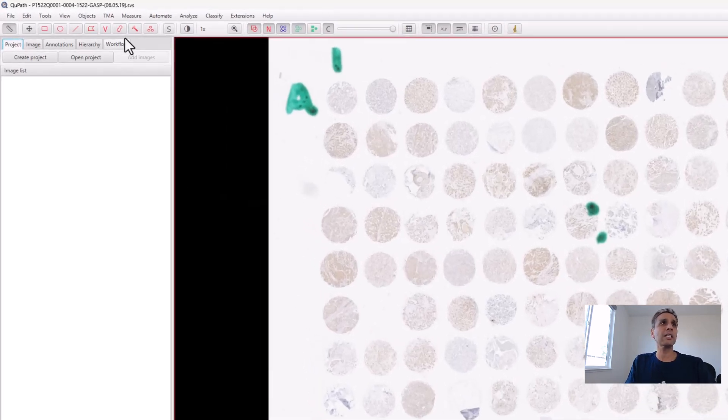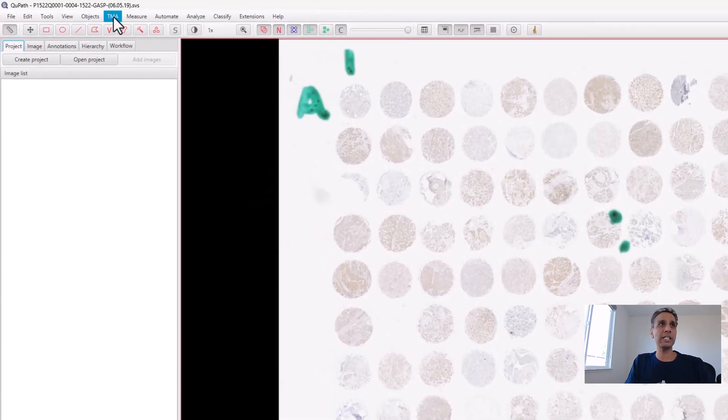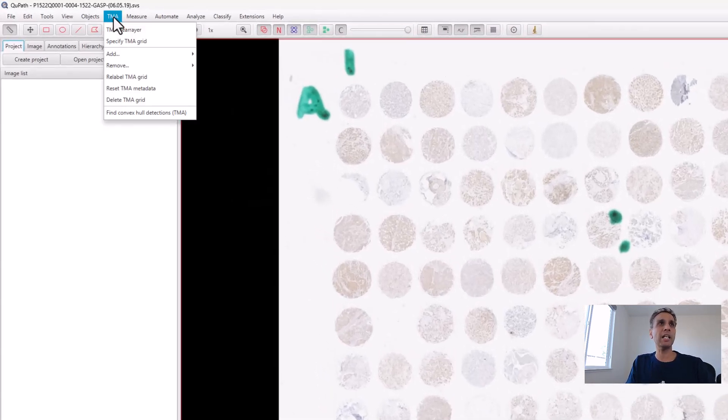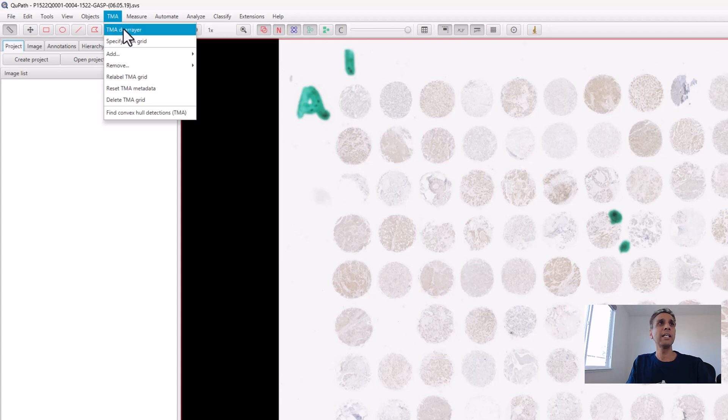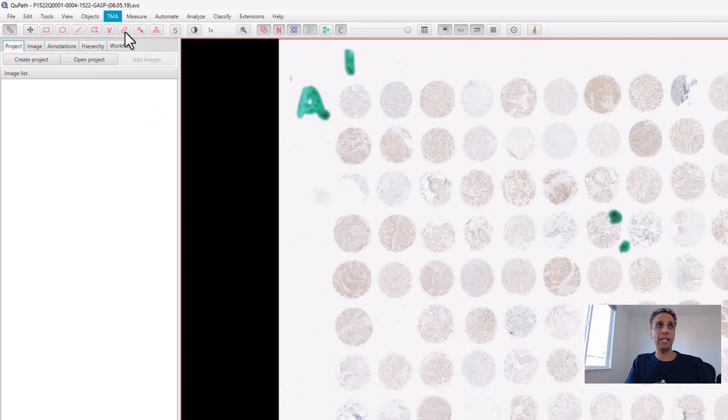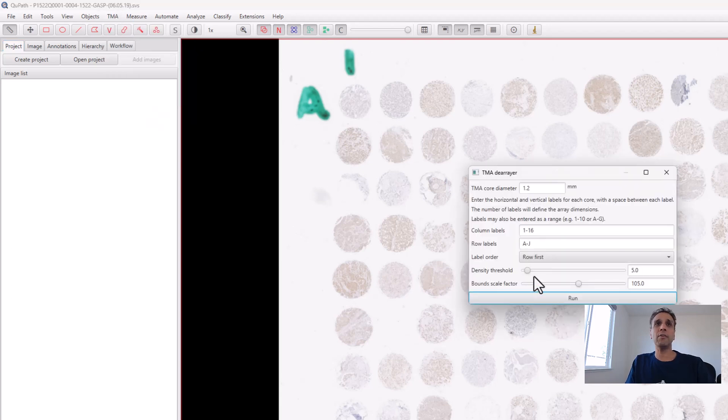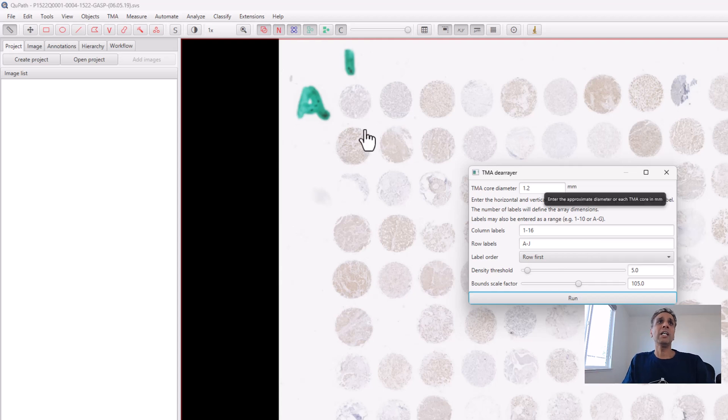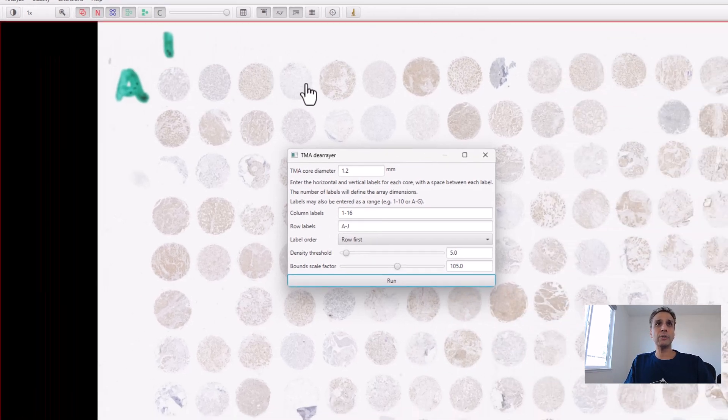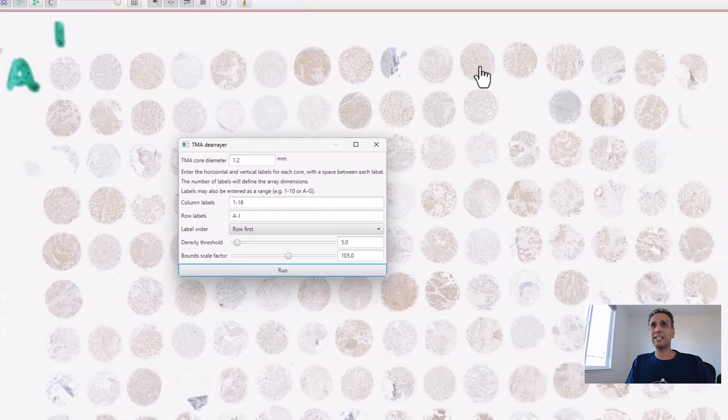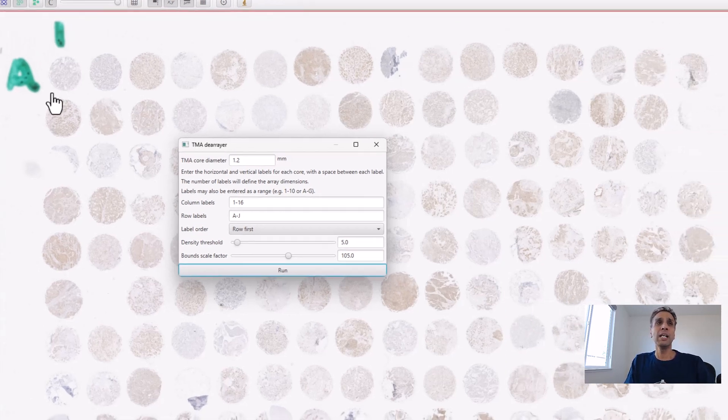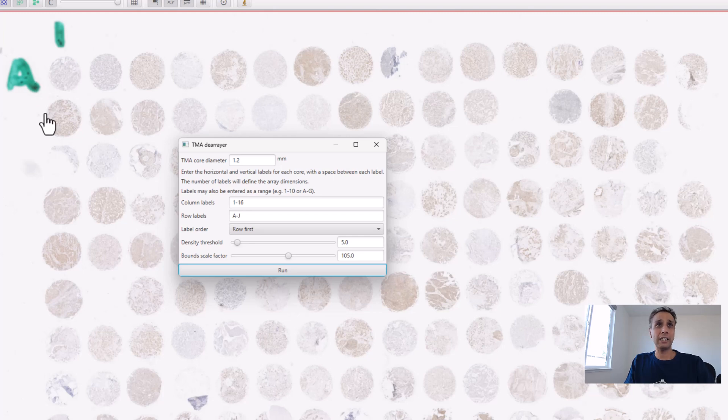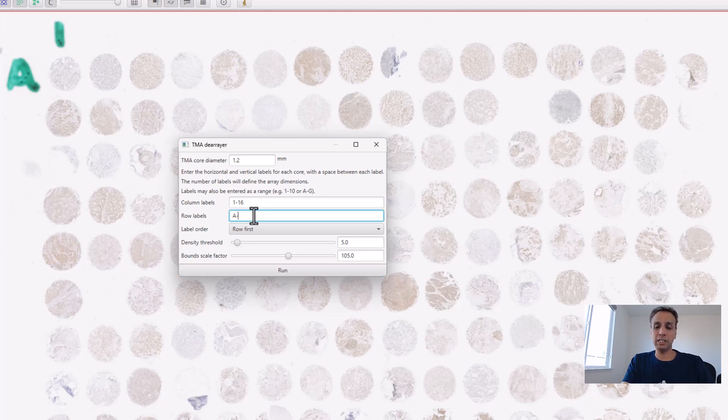The only analysis I want to do is TMA de-array. The coordinates work as you can see: columns 1-16 and rows are alphabetical A through L. Each core diameter is about 1.2 millimeters. Let's run this.